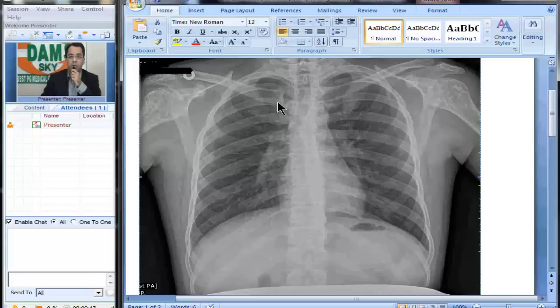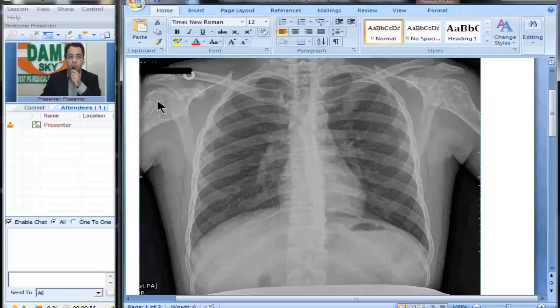If we compare the lung fields one by one, they look normal. Let us look at the bony cage. What is this? Are you able to see some spots, some sclerotic foci around the shoulder joint, in the humeral head, in the acromion process? Are you able to see?